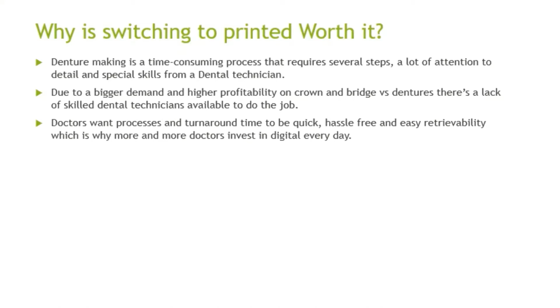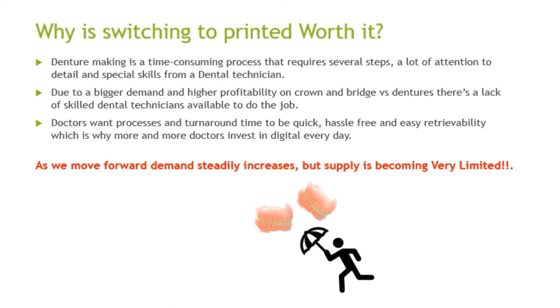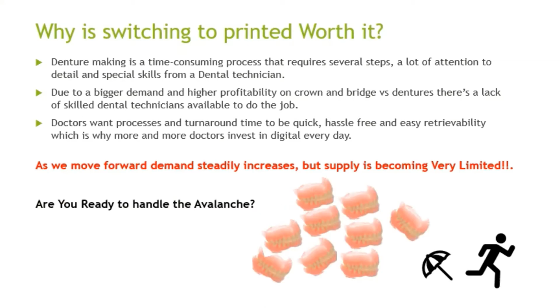Lastly, doctors want processes and turnaround times to be quicker and faster every time, and hassle-free with easy retrievability. So if you're doing conventional dentures, not only can you not retrieve them easily, but your turnaround times become longer than if you're doing digital. Basically, as we move forward, demand steadily increases, but supply is becoming very limited. So, are you ready to handle the avalanche?